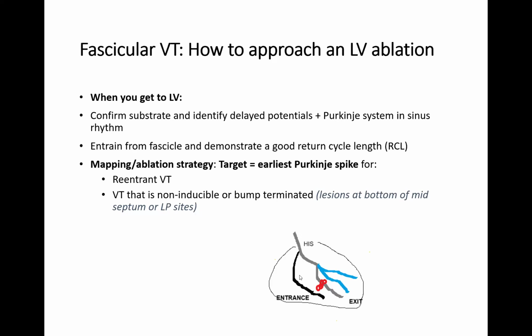And our ablation site is the area where the P1 potential is very well distinguished. The exit site is also good, but still the P1 potential is much more helpful than the others. Yeah, thank you. Thank you very much.